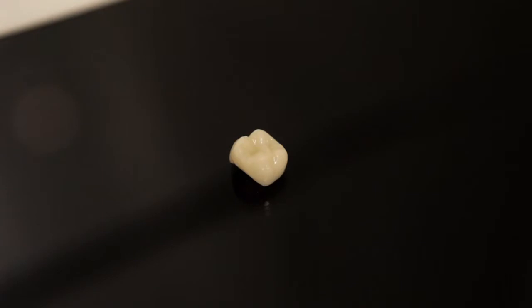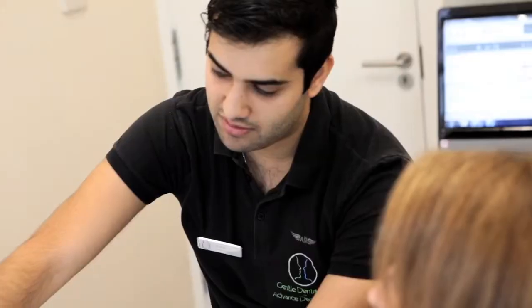The crown itself feels better than my teeth, and I'm not just saying that. After it was done, he just cemented it in — it took no time at all. It never hurt and it feels smoother and better than my actual teeth do. I haven't had any discomfort or anything. I was able to eat right away. It's an incredible experience.